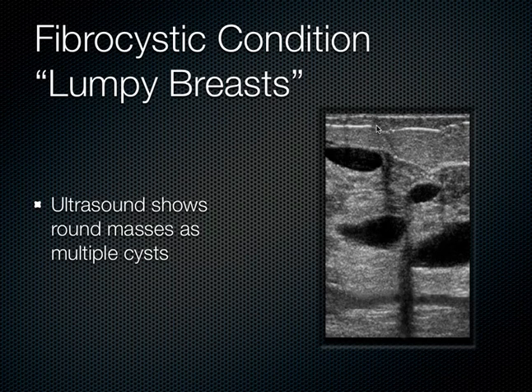The sound is going through this skin and then into this glandular tissue here, and it reaches this cystic structure, and then the sound is redirected. And so it goes through here, and then it gets redirected. And on the edges of that cystic structure, we get these lateral shadows. Sometimes we call it lateral cystic shadowing, or refraction artifact. The sound is being redirected. So that's why we see these shadows here on the edges of these cystic structures.